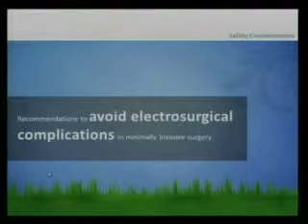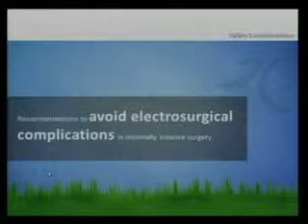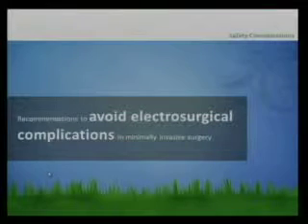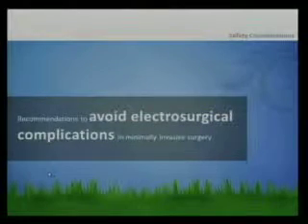Okay, that has been happening, so everybody should pay attention. It's been happening in spatulas a lot. So when you are doing a case, remind the attendings, because we sometimes forget when we focus in on something else. The insulation on the spatula has been coming off. He was over the other day, and it was frying the crap out of tissue way above what we were trying to do.